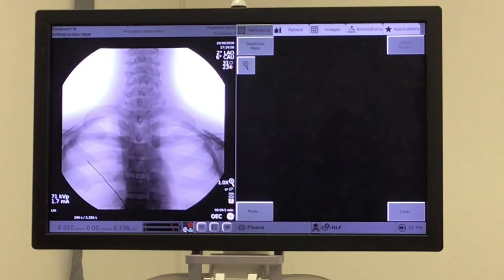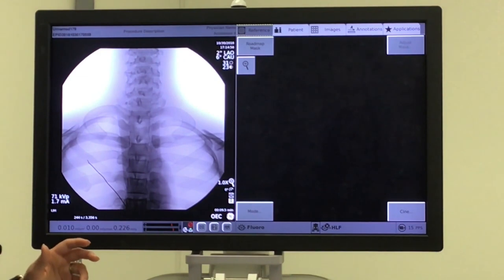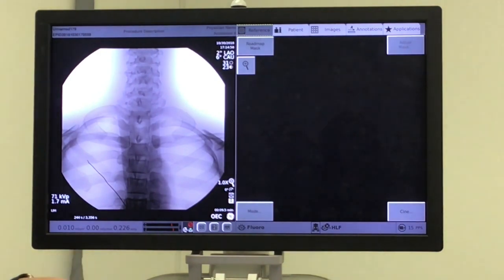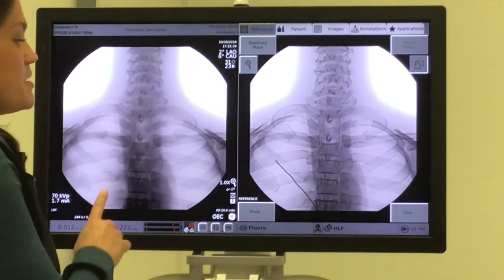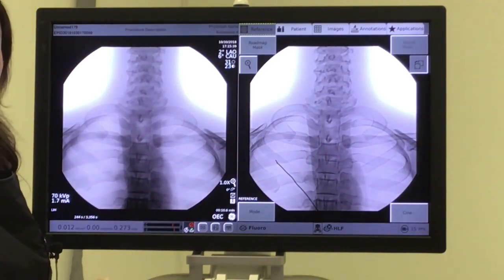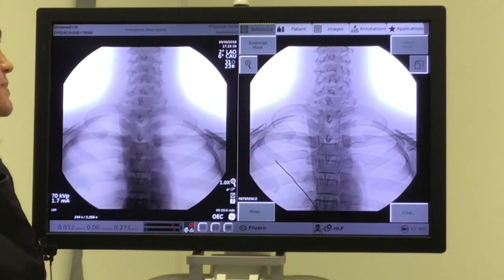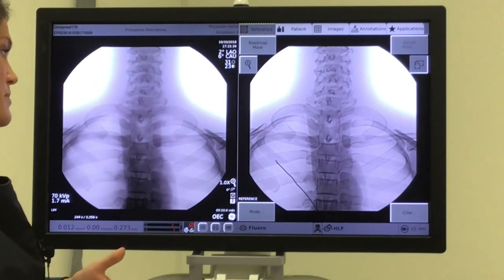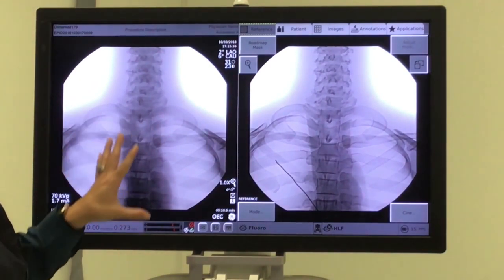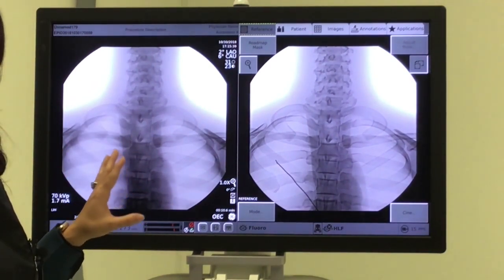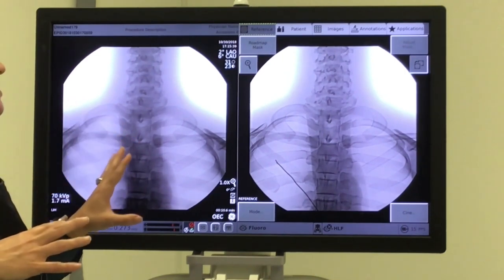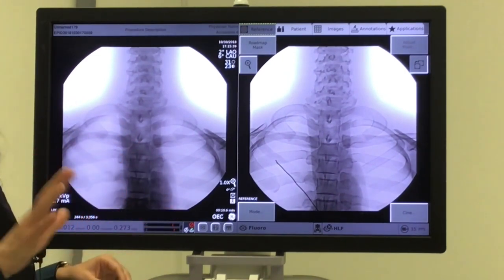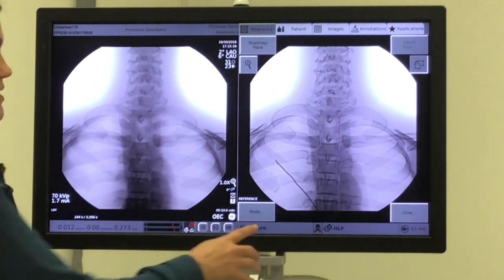Again, bone is very black and white, soft tissue is not as important. One of the benefits of the orthopedic profile is a built-in feature called Smart Metal. What Smart Metal does is when metal is introduced into the field, it's going to balance out your bone brightness and contrast with that metal in the field — but we'll dive into that a little bit later.